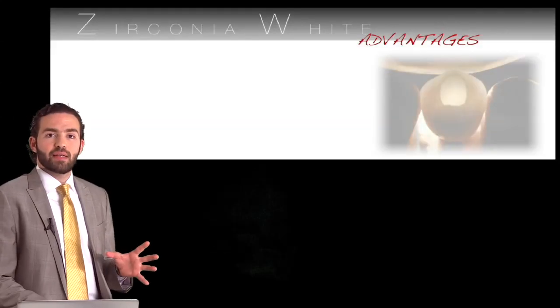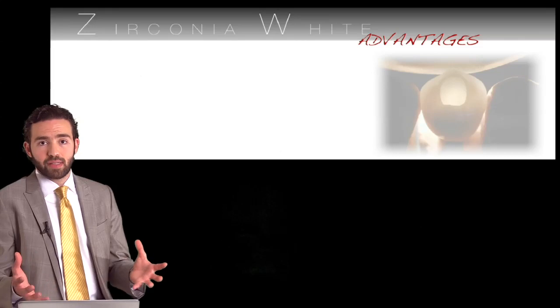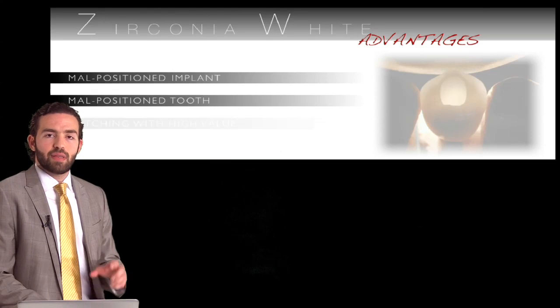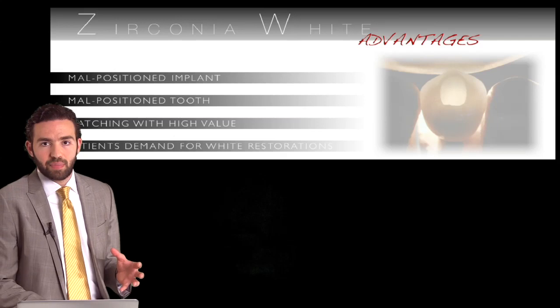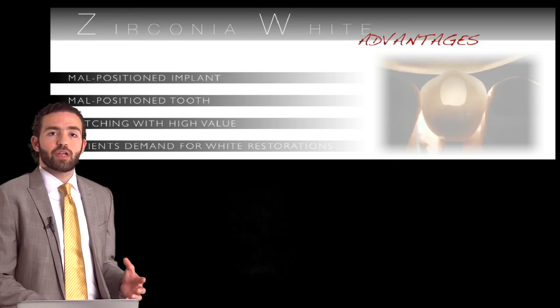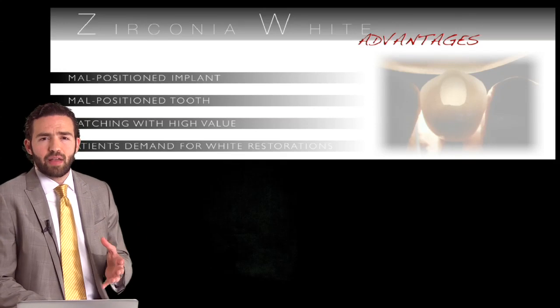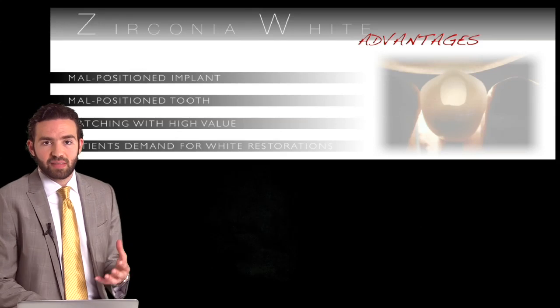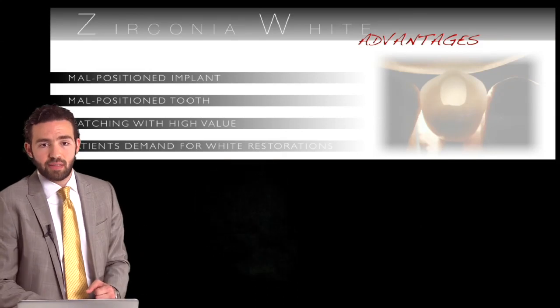Alright then, how can we take the best out of the zirconia white restorations? We know that zirconia is white or tooth colored, but how can we make the best out of that? And really there are four advantages of zirconia being white. Number one, we can use it on malpositioned implants and malpositioned teeth. And also we can use it when we are matching a restoration to a really high value or bleached tooth, and zirconia is probably the best substrate because it is already a white substrate that can allow the matching to be easier.